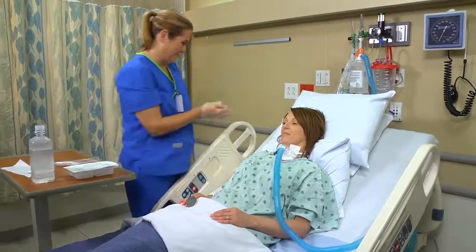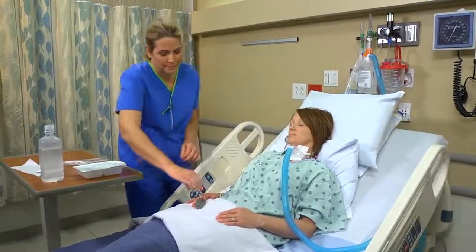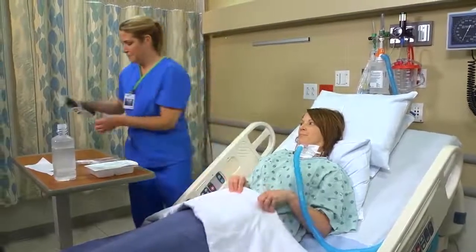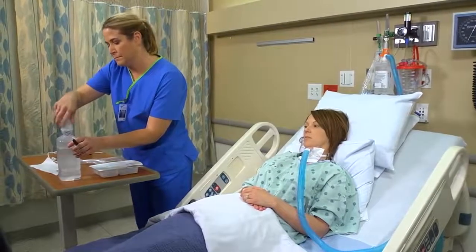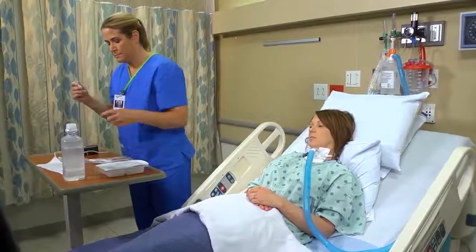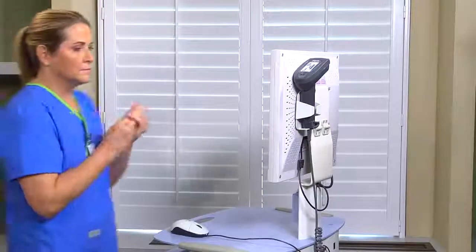When you've finished providing tracheostomy care, position the patient comfortably. Remove and discard your gloves and face shield if used. Replace the cap on the bottle of saline, date the container, and store it and any other reusable liquid. Finally, perform hand hygiene and document your care.